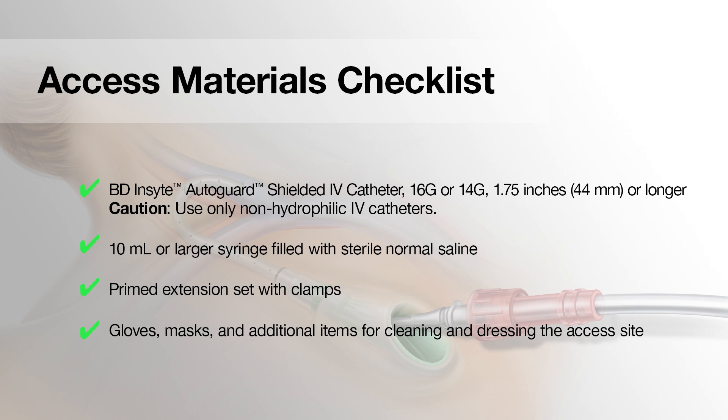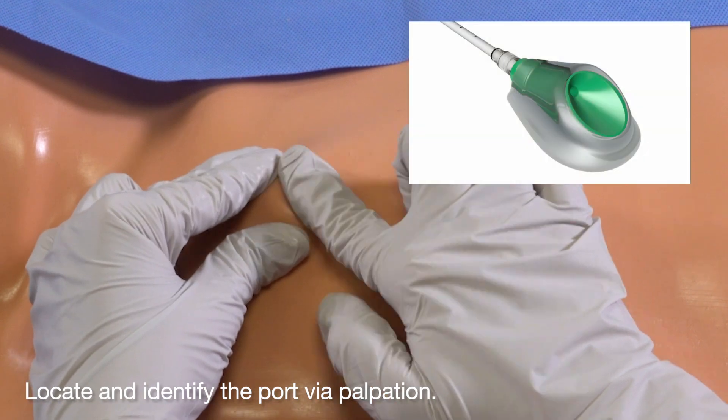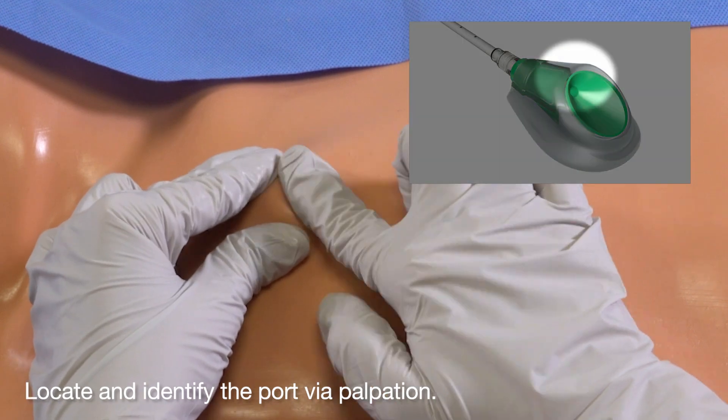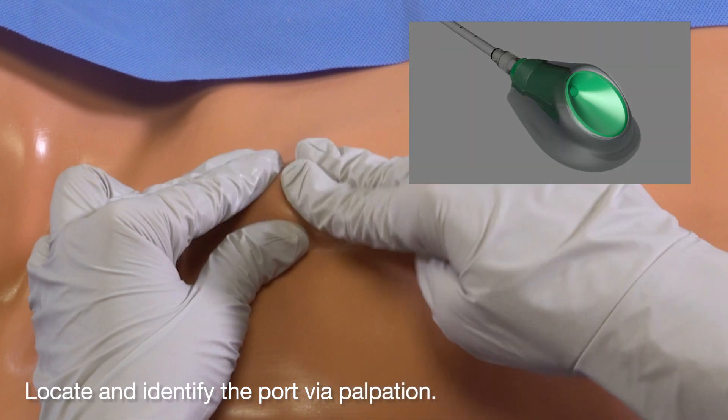Prepare the following materials for access. Locate and identify the port via palpation. Place your finger on the high point of the device to identify the top of the funnel. Palpate the funnel, which should feel concave and hollow.